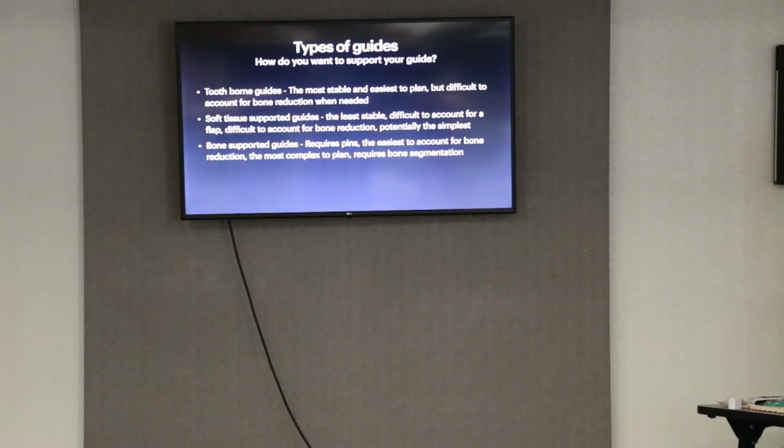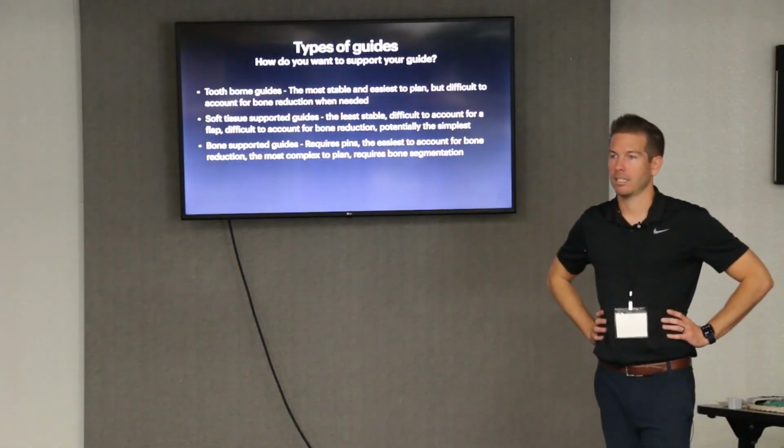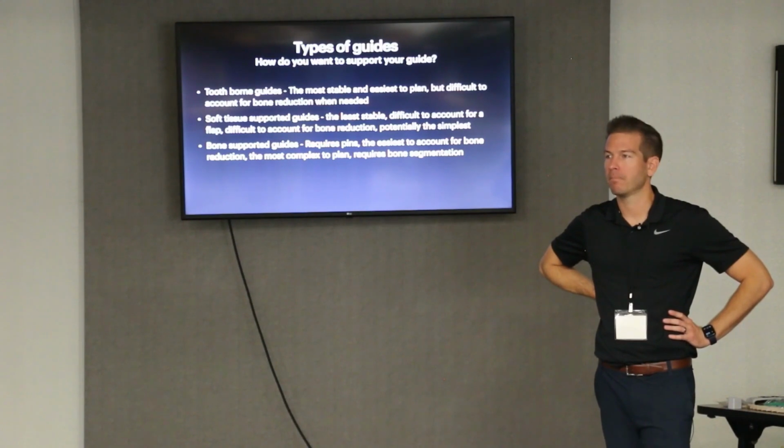On that case, say where you selectively extract and place your implants super deep in that bone, you're just eyeballing a 3 millimeter reduction of bone after that. Exactly, or whatever your bone reduction is based on your plan. That's exactly right. You're just measuring with a probe where you can see your implant platform is now a millimeter below the bone, and you're good. Exactly right.